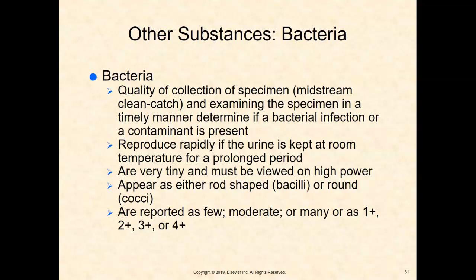So we have to look at it as soon as possible. They can have various shapes, and we report it as few, moderate, or many, because a few might not really mean anything, but many is usually very significant.